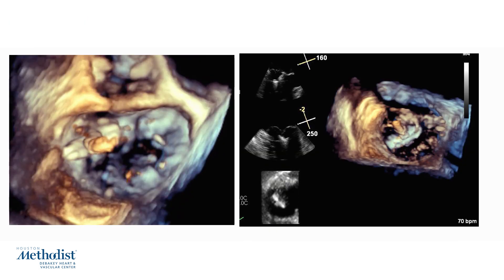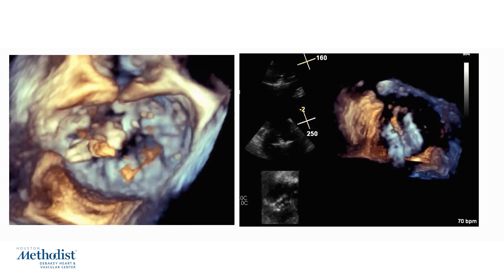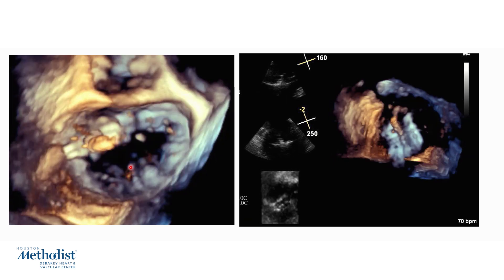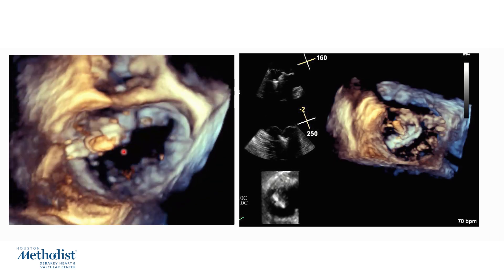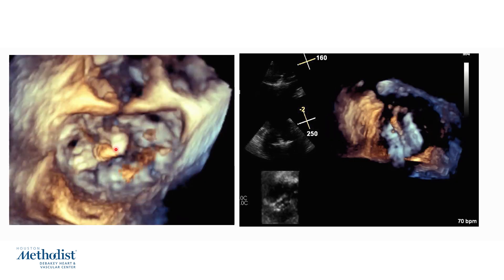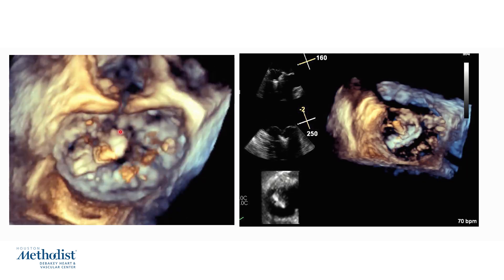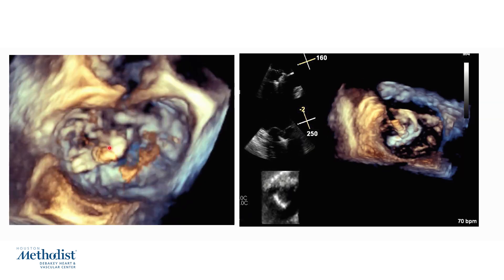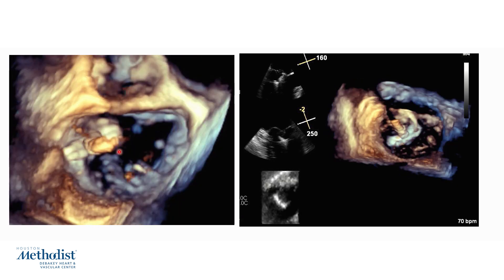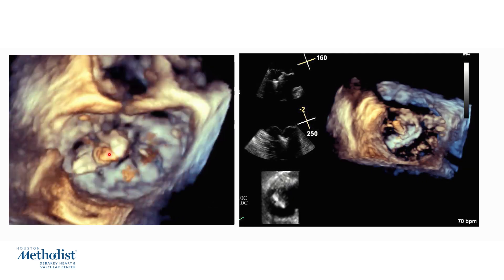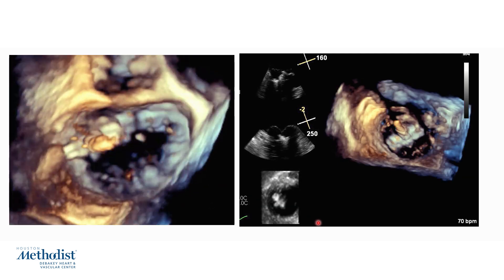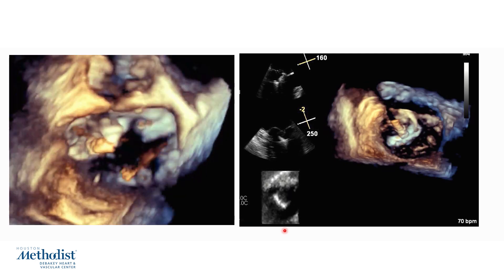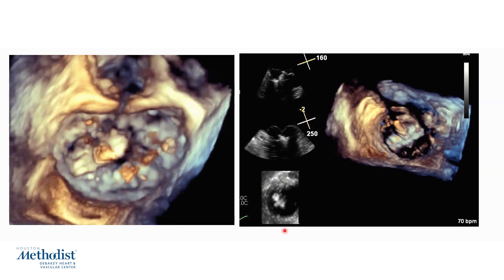Here is the first clip. Routine transseptal puncture was performed under 3D echo guidance and fluoroscopy. We have an XTW clip advanced through the clip guide above the mitral valve in the left atrium. We are positioning this at 2 o'clock to 8 o'clock to align it perpendicular to the line of coaptation. If we are positioning the clip in the center, we go 12 o'clock to 6 o'clock. However, in the lateral and medial aspects we align slightly differently. We use 3D MPR, as demonstrated in the right panel, to align and advance the clip across the flail segment of the P1 scallop.